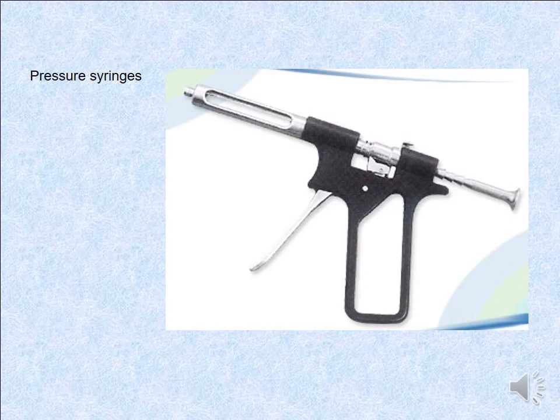The pressure syringe we use in very dense bone or the palatal side of the palate, but it gives high pressure.